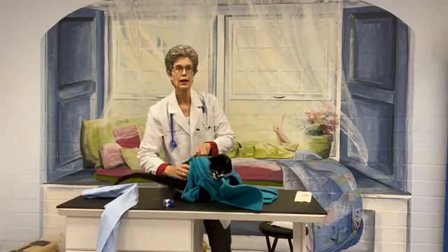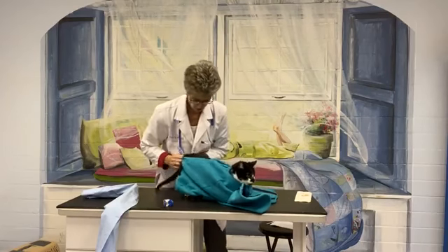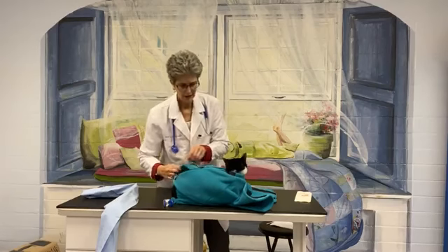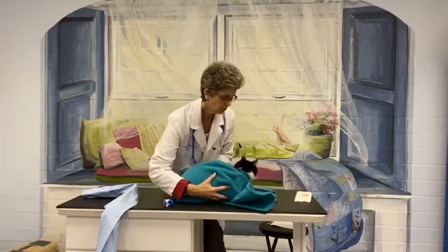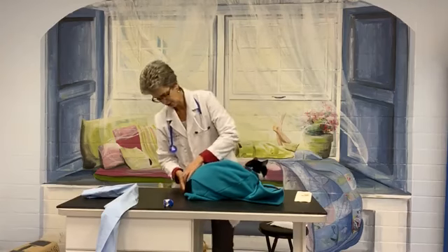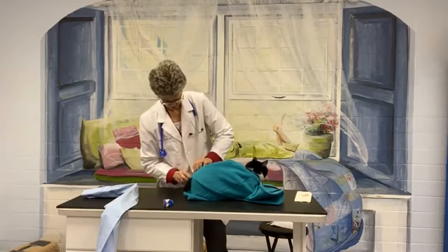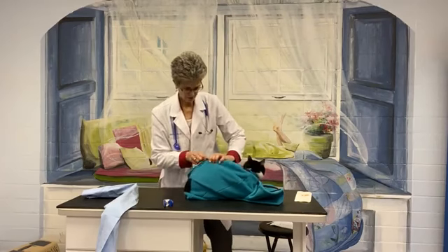Then zip. I think working the zipper down is best. And then we may lift your little tush to get your back end in. Yes, I know. And the paws go down in the front, and pretty much they'll put them down there on their own. Now his little tail is out here, so I'm going to help tuck it in. I know, okay, there you go.